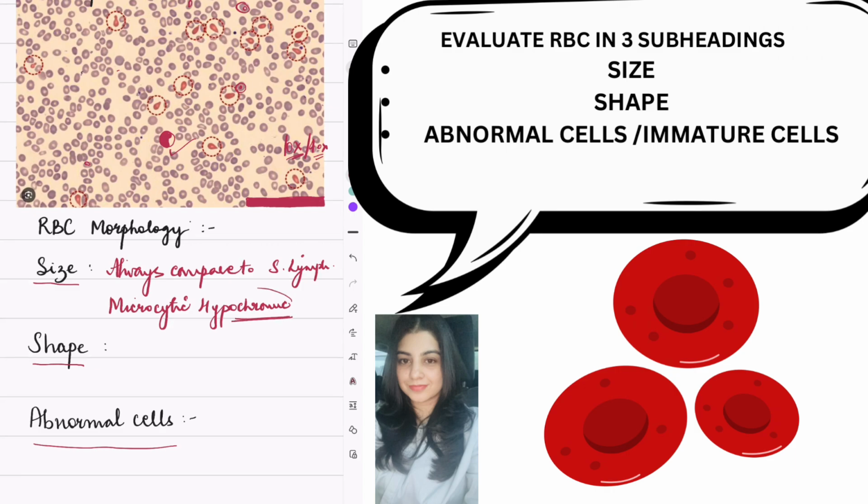As you can see, chrome. What is chrome, by the way? It's color. What is cytic, by the way? It's a cell. Micro means small, as you all know. Microscope, microbiology, anything micro is small. And hypo means something less. If it is more, then it will be hyper. So for example, there's an RBC which is filled with color and there is no central pallor, then it will be hyperchromic.